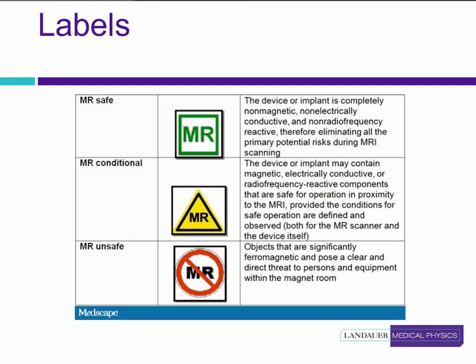It will contain objects which are safe for use in the MRI area under certain conditions. These conditions can be variable. The device may be safe for use with only one magnet in a suite with multiple systems, or safe for use only under certain conditions. Before moving it from its current location, care should be used. Either the device should be questioned with the MRI technology staff, or the label should indicate its appropriateness in various places.